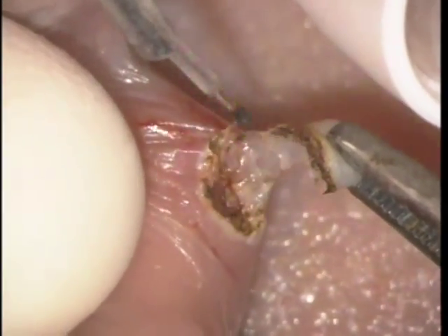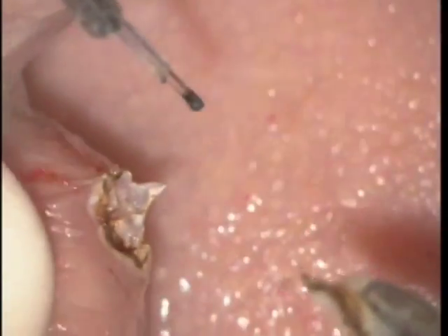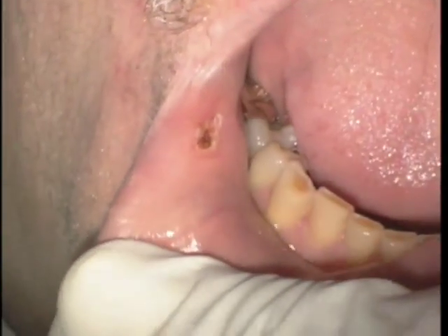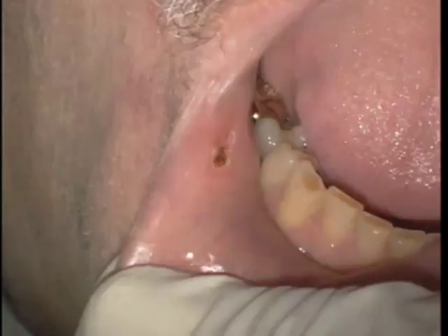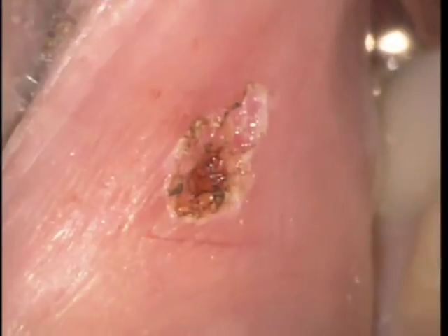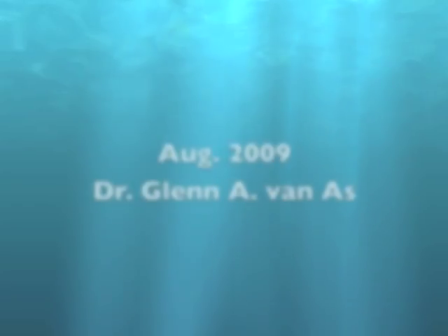After removal of the lesion it's sent in to a pathologist and we use hydrogen peroxide to clean up the tissue. You can see at low magnification what the lesion looks like. This will heal in by secondary intention — it needs no sutures — and at high magnification you can see a small lesion, no bleeding, and a perfectly healed result will appear in roughly 10 days to two weeks.